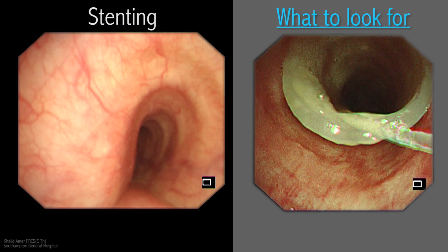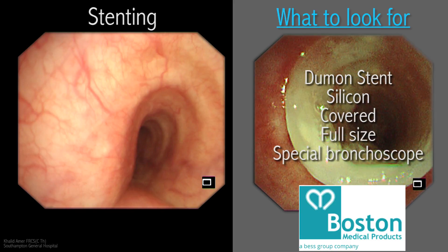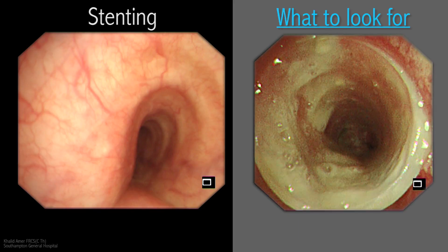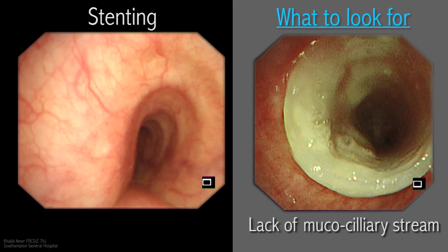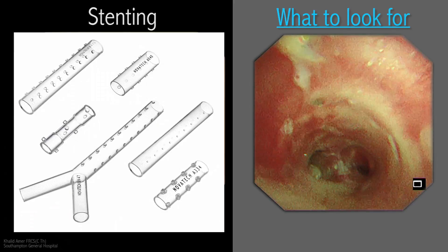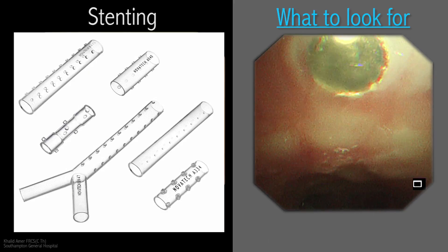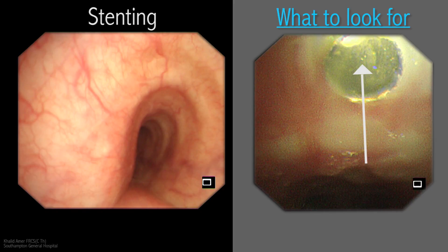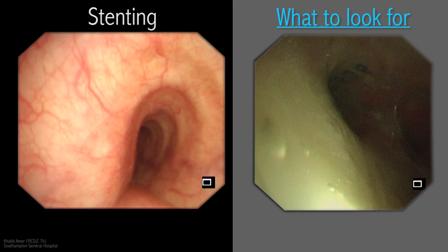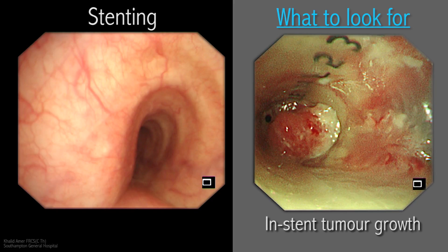There are many types of stents, both metal and silicone, such as the Dumont stent. The Dumont stent is covered and is full-size at the time of launching, requiring a special rigid scope for insertion. They come in different shapes and sizes and have radio-opaque dots to aid radiological identification. In my opinion, because they are covered, the mucociliary stream is lost, and they are not immune from tumour ingrowth and blockage.